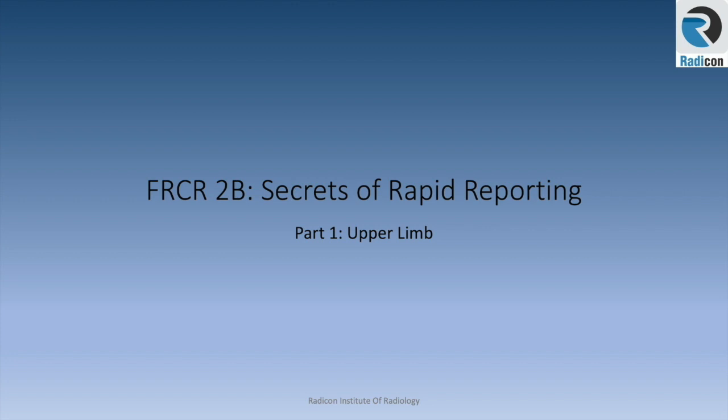Welcome to Radicon Institute. As you know, FRCR has various components. Each component has its own secrets and techniques. We will learn how to pass each component separately, confidently, and easily. This presentation covers rapid reporting for upper limb. We will show you how to deal with upper limb films in exam and real life with review of important cases. This is Dr. B, and I will be your study partner in this presentation.